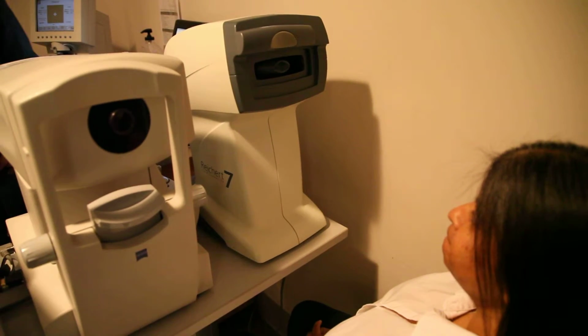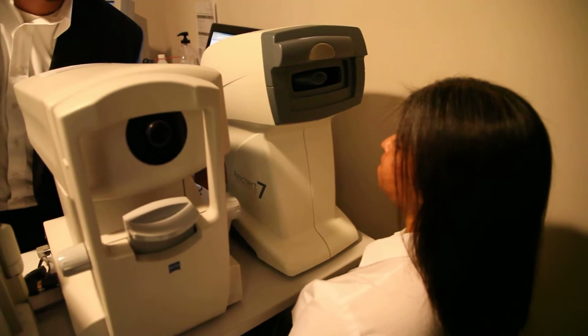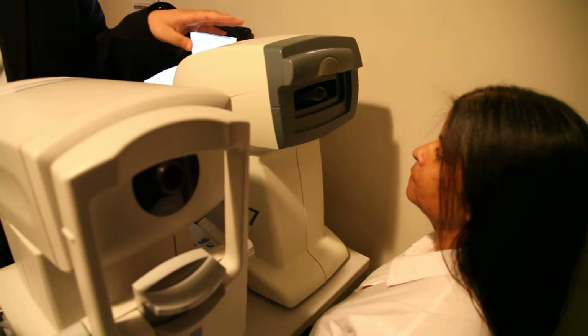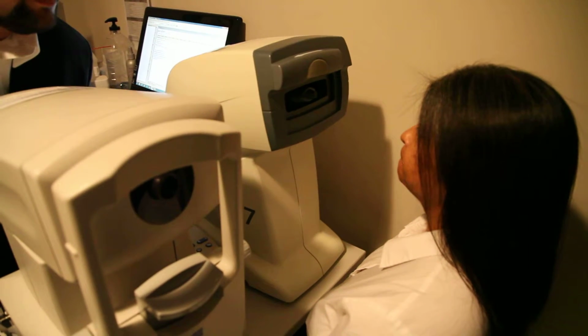Okay, so under normal conditions you would turn off the light at this point. Okay, so now you get the patient situated, you let them know, Mrs. Test, the very first instrument we're going to do is the one all the way on your right. This is the eye puff test. Okay, and I'm just going to get this adjusted.